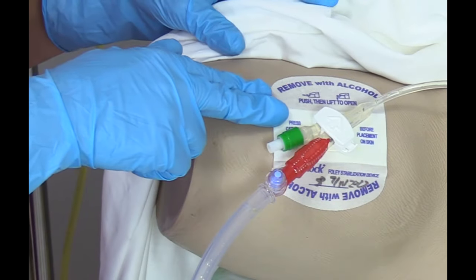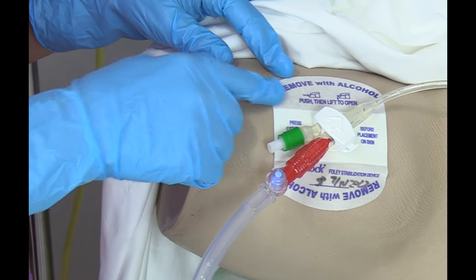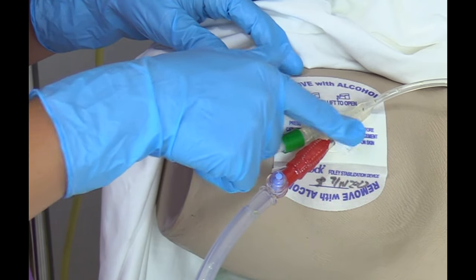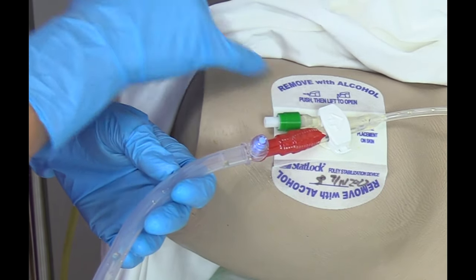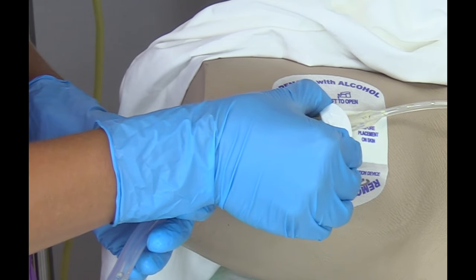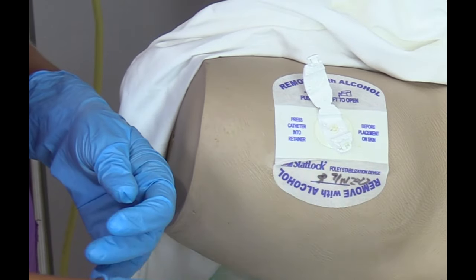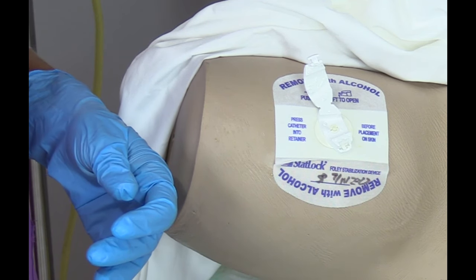To remove this device, you're going to need several alcohol prep pads. First, before you remove the adhesive, you want to unclip the catheter from the clip in the device. If you ever forget, it has instructions right on the device — you push the sides in and it just pops off very easily. Then we're going to lift this up carefully and lay it right here where it will be safe and secure.